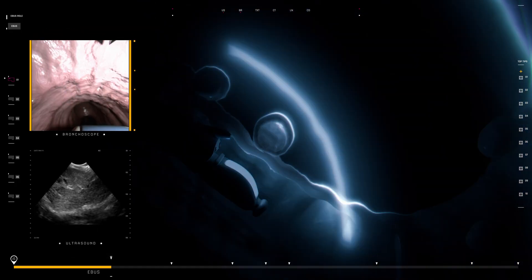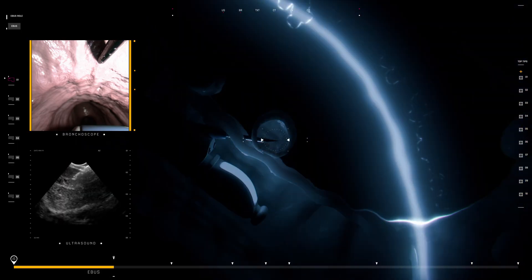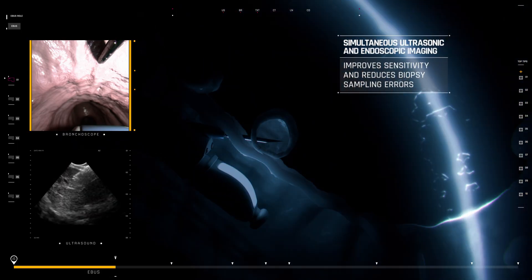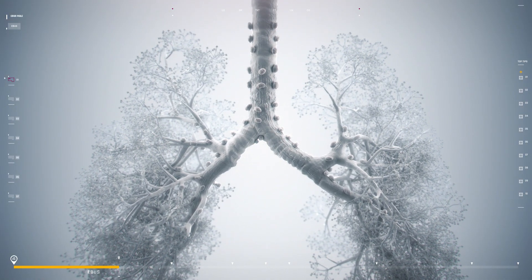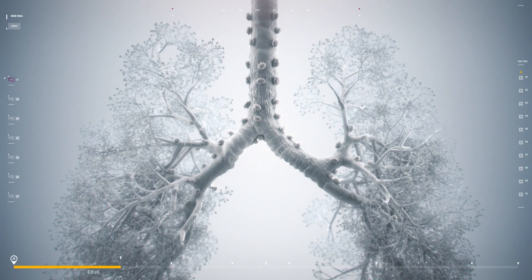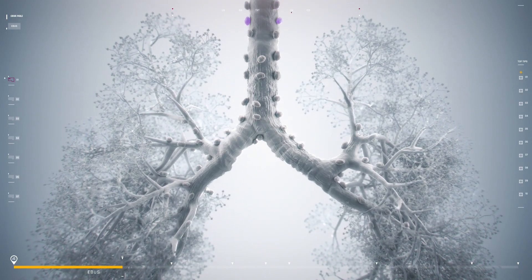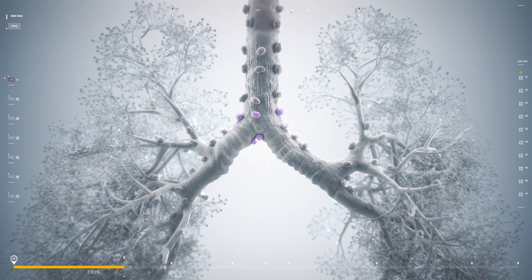EBUS-guided transbronchial needle aspiration allows adequate sampling of all intrathoracic lymph nodes adjacent to the bronchial tree, including stations 10R, 10L, 11R, and 11L, which are inaccessible by other more invasive techniques.